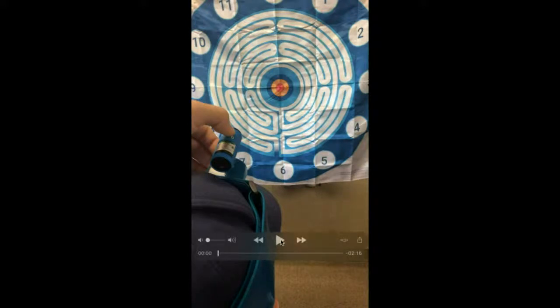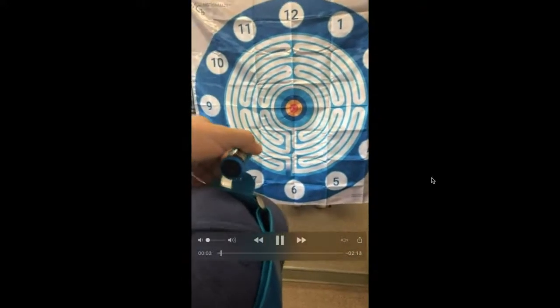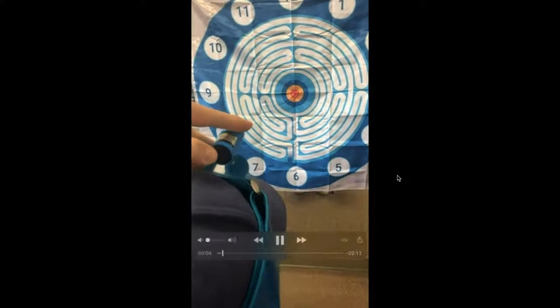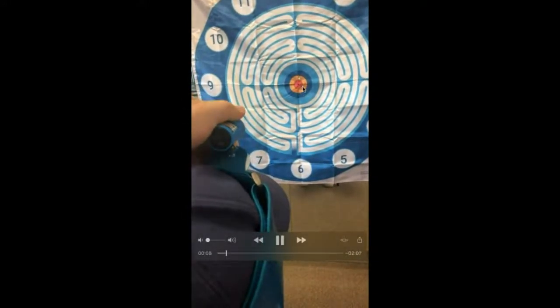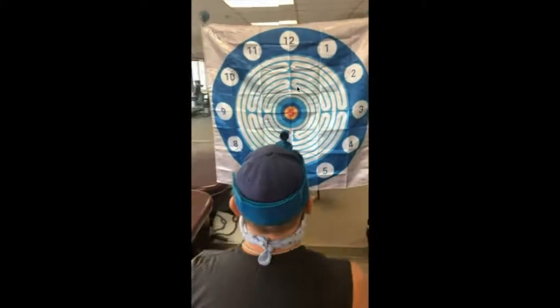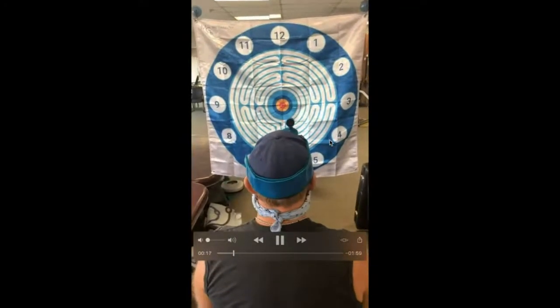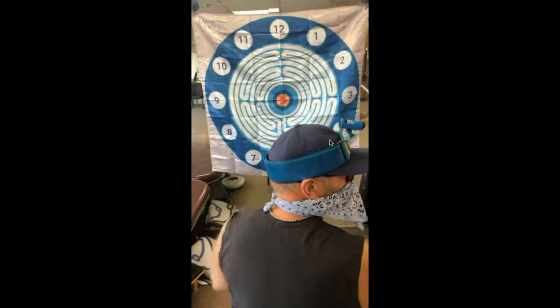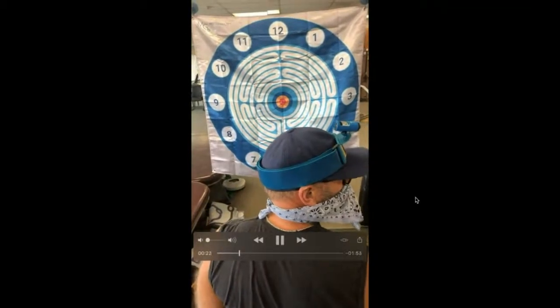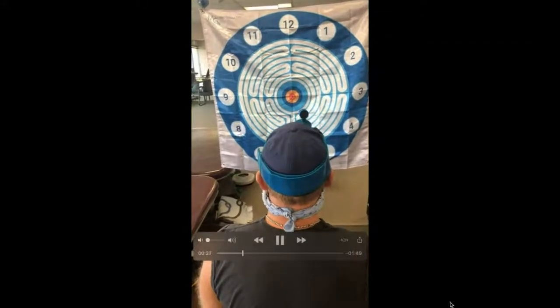So if we look at this gentleman doing the standard testing, the beauty of the ball and socket joint right here is that he can look at the center target, and then I'm moving the laser down into it. Don't have them move it down into it. They want to keep their original posture there. He's going to perform a repetition of eyes open. You can cue him to not turn his torso, of course, or put a laser on the torso. And then we can do eyes closed.